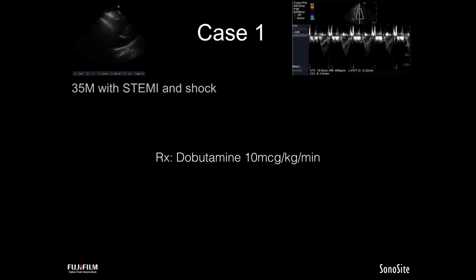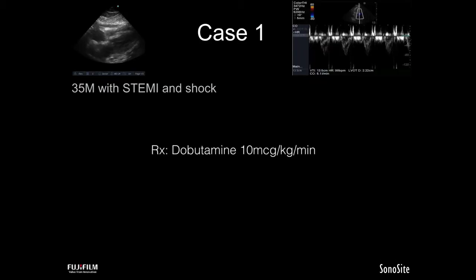We started some inotropy, saying we've got a stroke volume issue. The stroke volume issue is related to a contractility problem, recalling, of course, that stroke volume is a summation of preload, contractility, and afterload. And really, this boils down to, at the minimum, a contractility problem. We have drugs that can help this. So dobutamine was started at a generous dose.